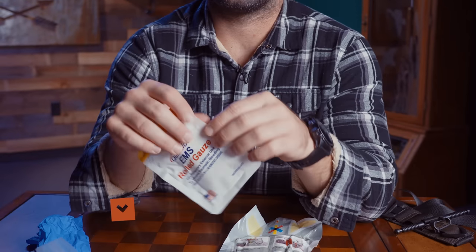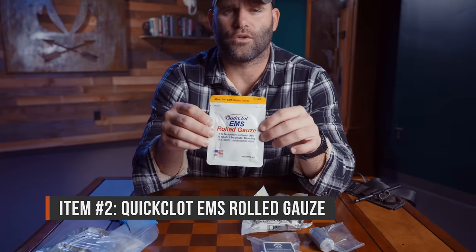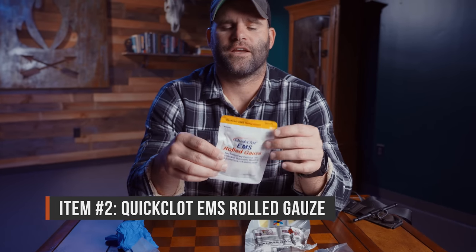The next most important part is our hemostatic agent. We have our rolled gauze — QuikClot combat gauze. This gauze is impregnated with a hemostatic agent, which is essentially a chemical that is going to help stop bleeding faster. It recruits more of the body's natural clotting factors to quickly get a clot. There's only so much in here though, and depending on how big the injury is — a large wound cavity or whatever the problem might be — you may need more.